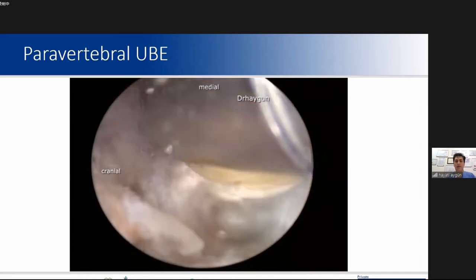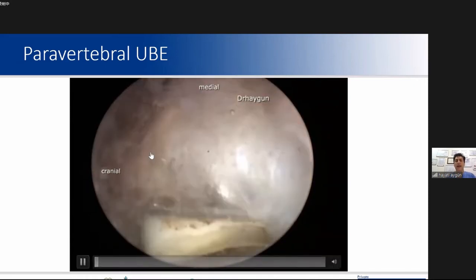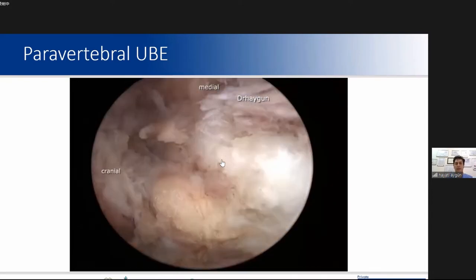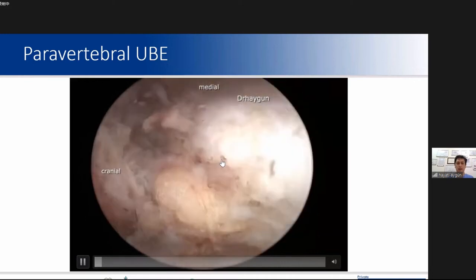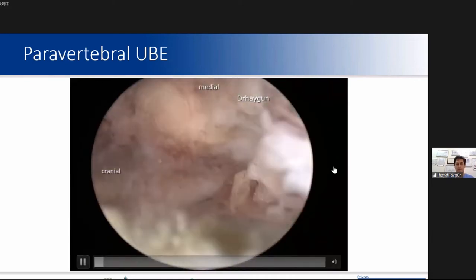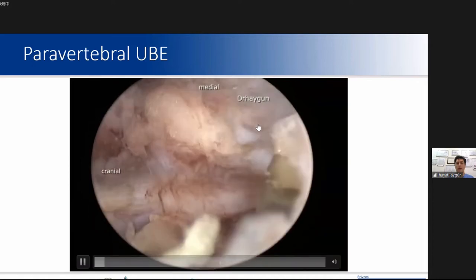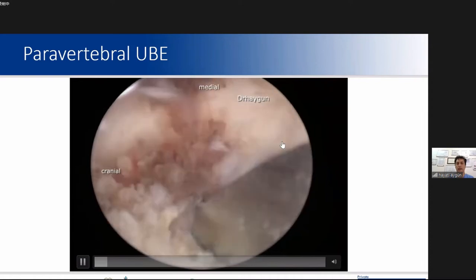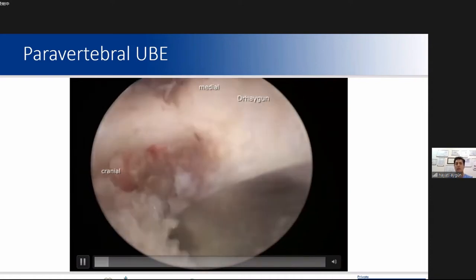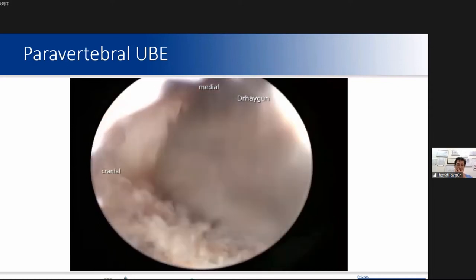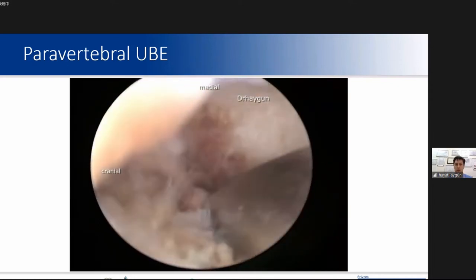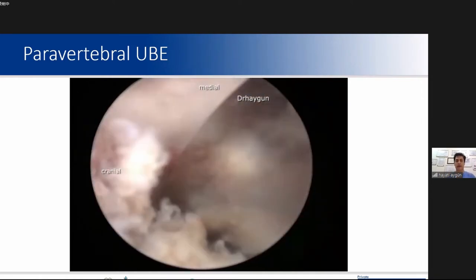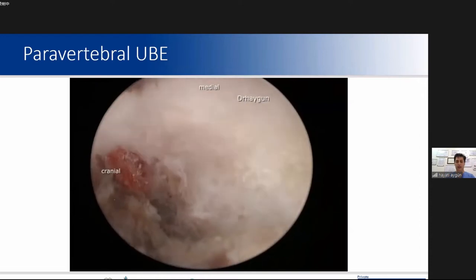After triangulation, you can see the initial endoscopic view. We are creating the working space with the radiofrequency probe. Here you can see the facet joint, facet joint capsule, and tip. With the high-speed burr or arthroscopic shaver, we are performing a facet joint osteotomy.